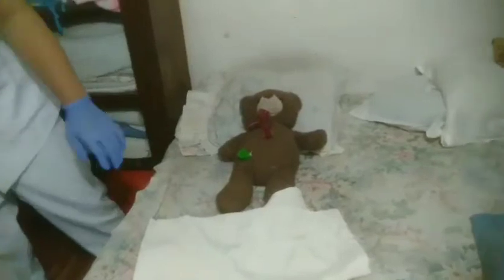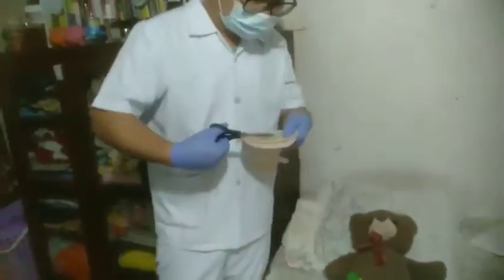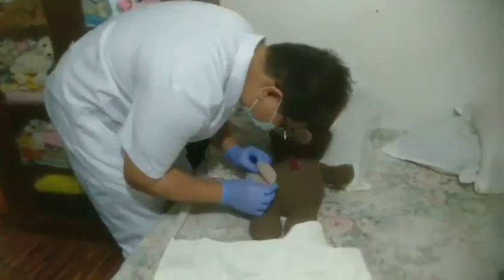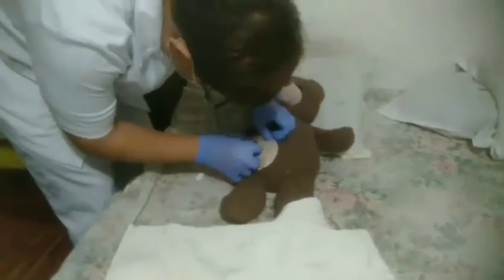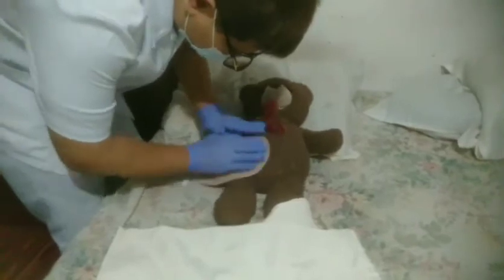Okay, and then you remove the excess dirt after you have cleansed it. Now place a piece of gauze and pad over the client's stoma, and then apply some paste-type skin barrier if needed or necessary. Now make sure also to resize the shape of the stoma opening by cutting it, and then remove the tissue around the stoma before applying the pouch. Prepare and apply clean appliances.